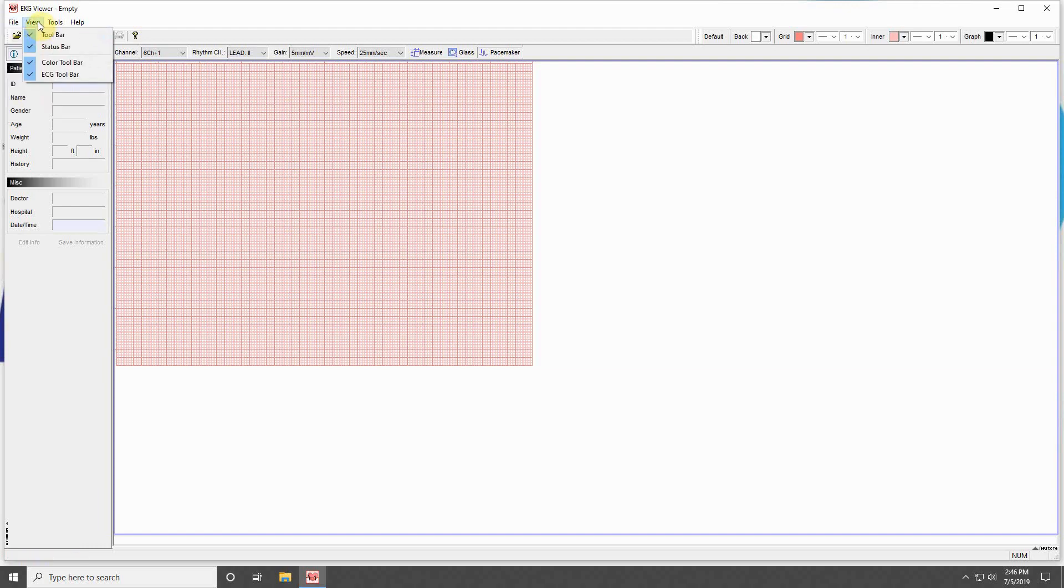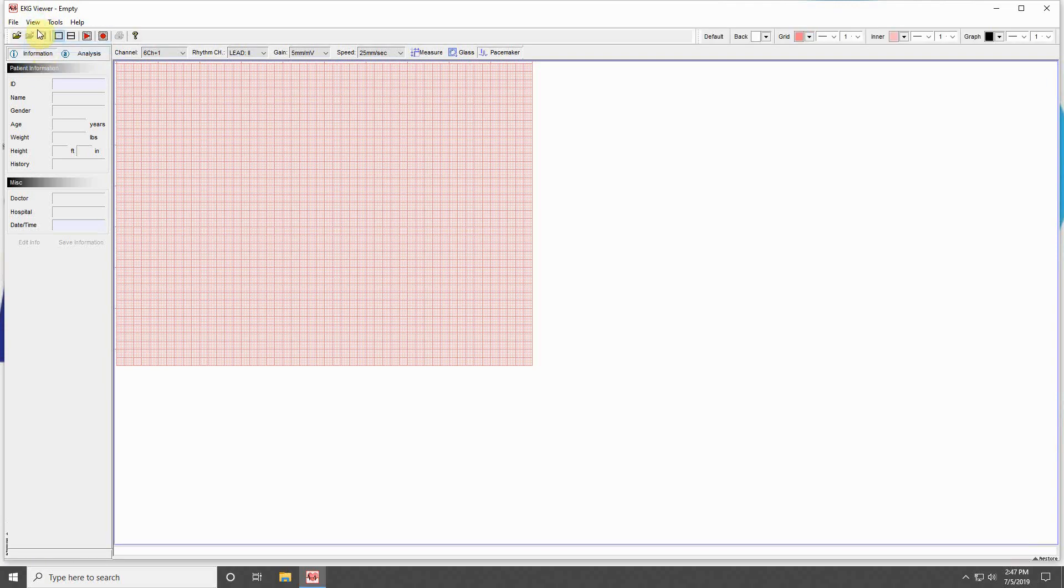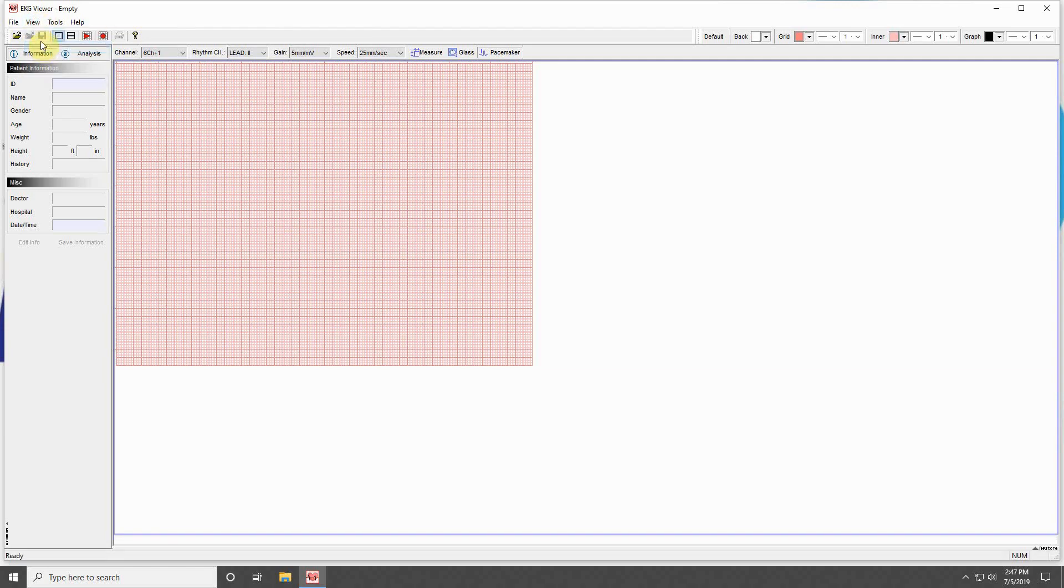The View menu allows you to choose which toolbars you would like to display in the program. The toolbars with the check next to them are currently displaying on the main screen.